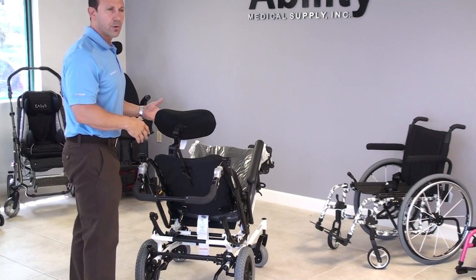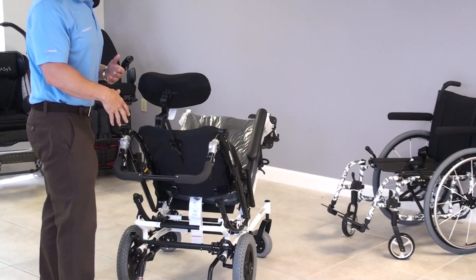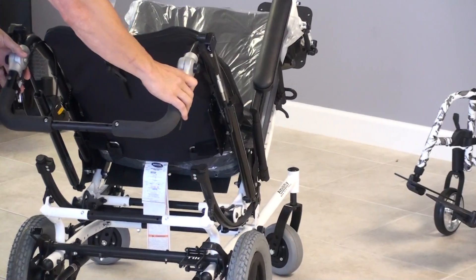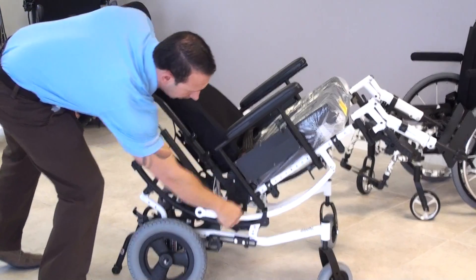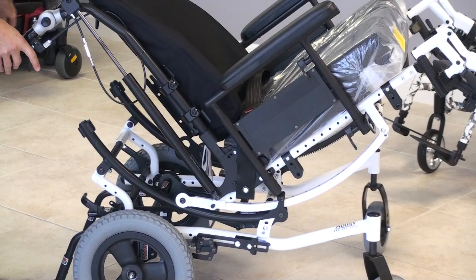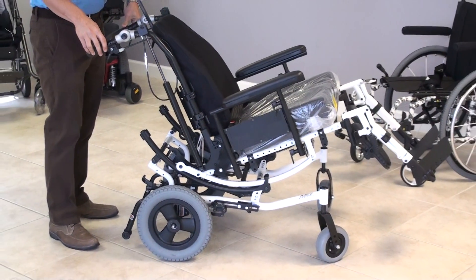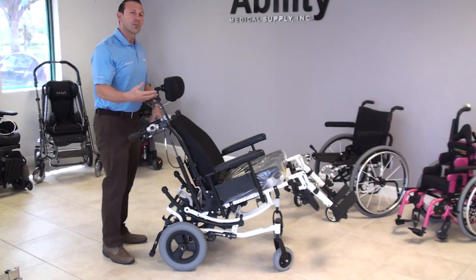The tilt feature is used for pressure relief to prevent people from developing wounds from sitting in one place for a long period of time. It's also good for tone management and comfort as well. You'll also see numbers on the side that tell you the degrees you are tilted at, so you can change the degree of tilt and read what angle you're at right there on the side. We don't reach true pressure relief until we hit about 40 degrees — that's when we get the real maximum benefit of a system like this.